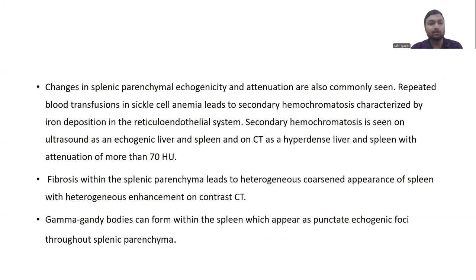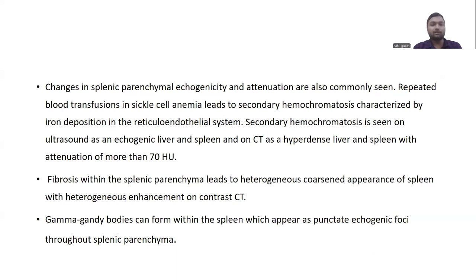Other complications include changes in splenic parenchymal echogenicity and attenuation. Repeated blood transfusions in sickle cell anemia lead to secondary hemochromatosis, characterized by iron deposition in the reticuloendothelial system. This is seen on ultrasound as an echogenic liver and spleen, and on CT as a hyperdense liver and spleen with attenuation of more than 70 HU. There can also be fibrosis within the splenic parenchyma, leading to heterogeneous coarse echotexture, with heterogeneous enhancement on contrast imaging. Gamma-Gandy bodies can form within the spleen, appearing as punctate echogenic foci in the splenic parenchyma.